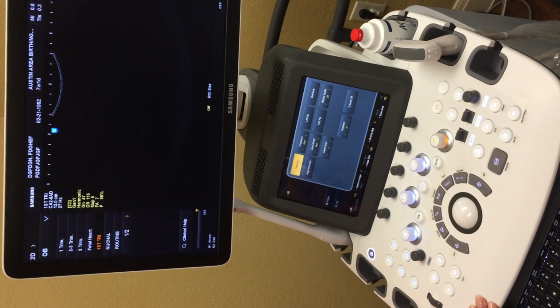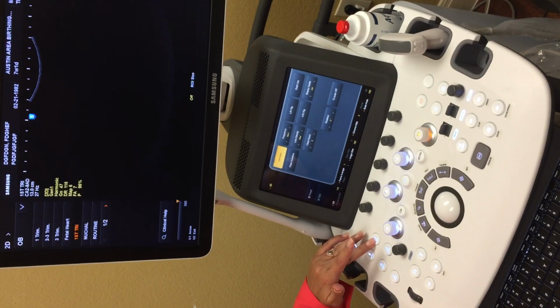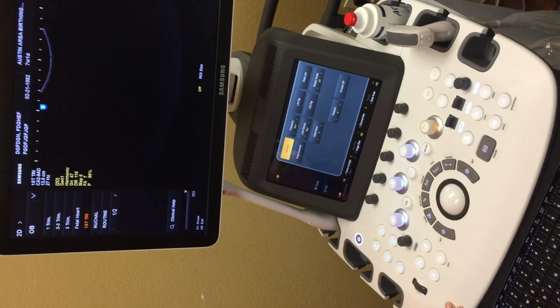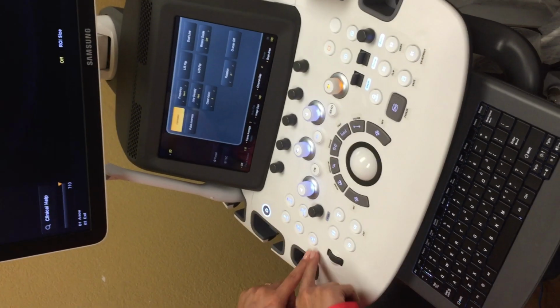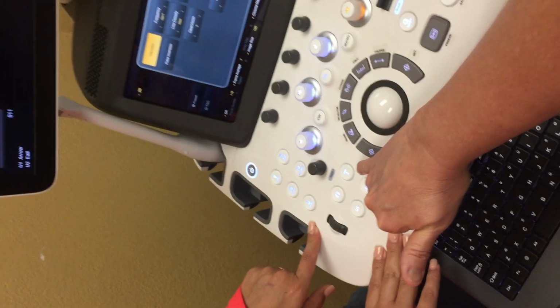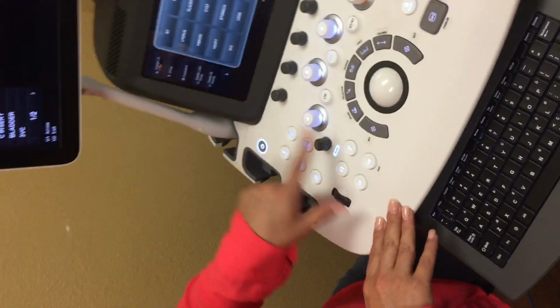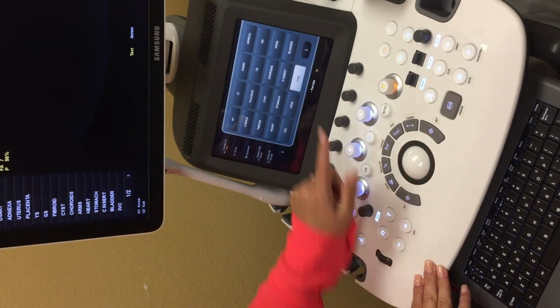Cool. And then if you are ready, end exam. Does that say end exam? Yep. Okay. Yeah, so anything I didn't label, it's because the system already labeled it. What is this key here? Text. So if we wanted to annotate, which is Annotation. Okay. Want to write text.